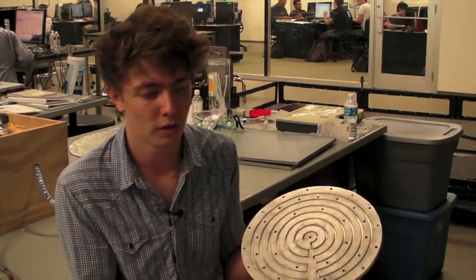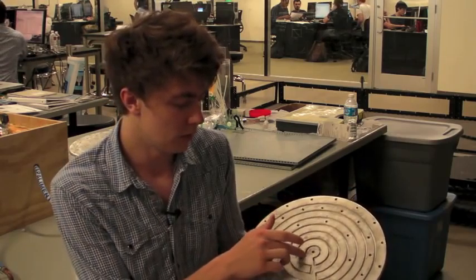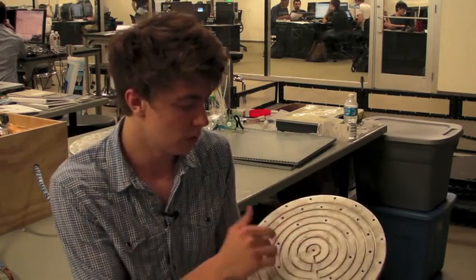Everyone's familiar with the traditional hot plate — that's what they use, just powered by propane stoves. Here we've gone for a renewable design. So steam enters here, it flows evenly around the surface of the plate, giving a nice, even heat transfer to the bottom of the autoclave.